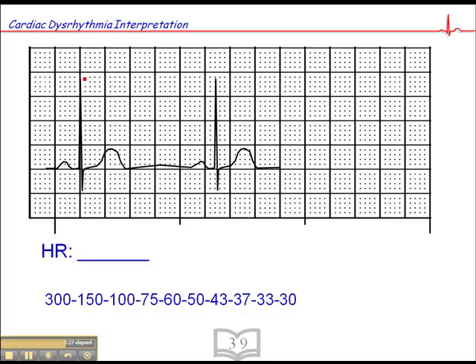This next one — the QRS falls on a dark line. We have 300, 150, 100, 75, 60, and 50. So the heart rate is between 50 and 60. Counting small squares: 52, 54, 56. So we have a sinus bradycardia of 56.